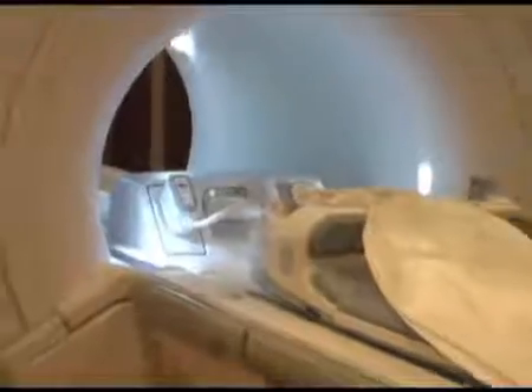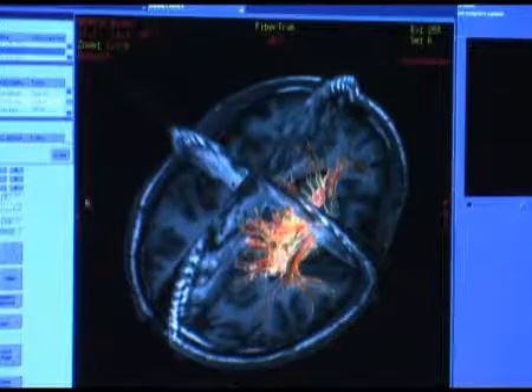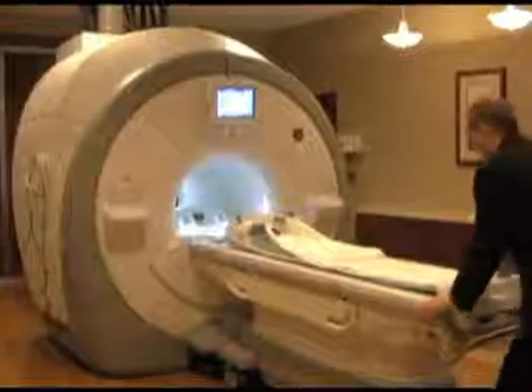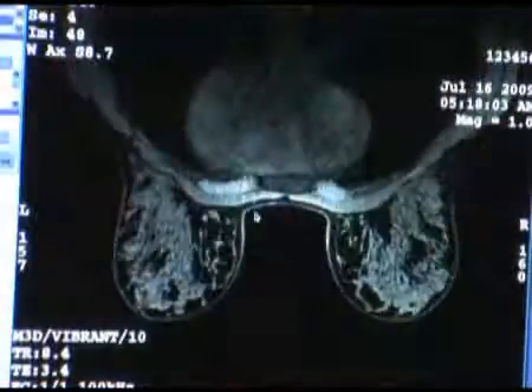The MR450W is a 1.5 Tesla system with a 70-centimeter bore and a 50-centimeter field of view, which according to GE offers high-quality imaging without compromise. The larger bore allows greater flexibility for abdominal and extremity imaging and also allows two-station spine imaging. The table holds up to 550 pounds and has a detachable design to facilitate patient throughput.